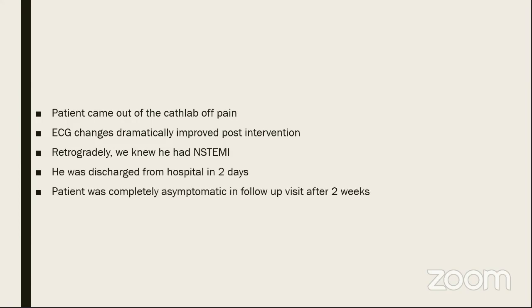The patient was completely asymptomatic at the follow-up visit after 2 weeks, and thus we did not consider playing around in the right coronary for this octogenarian man.